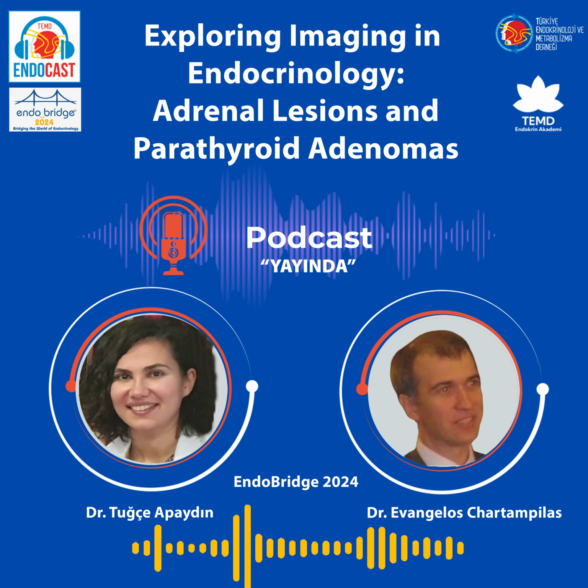I'd like to ask about adrenal imaging. What imaging methods should we perform first? Adrenal lesions. Okay, adrenals are incidentally detected. An adrenal lesion is usually incidentally detected on CT or MRI because it's very difficult to see the adrenals on ultrasound, particularly the left adrenal. Even if you know there's a tumor, it's very difficult to visualize it. So we are going for CT and MRI.